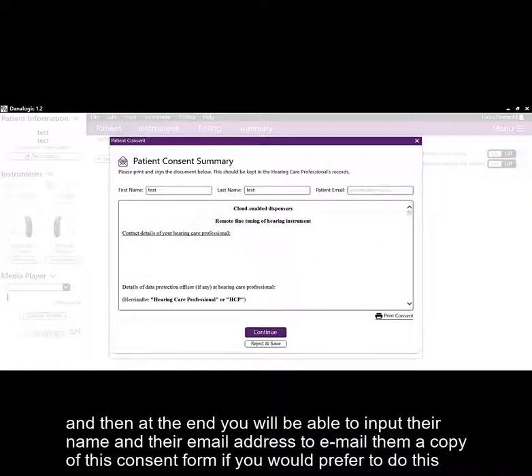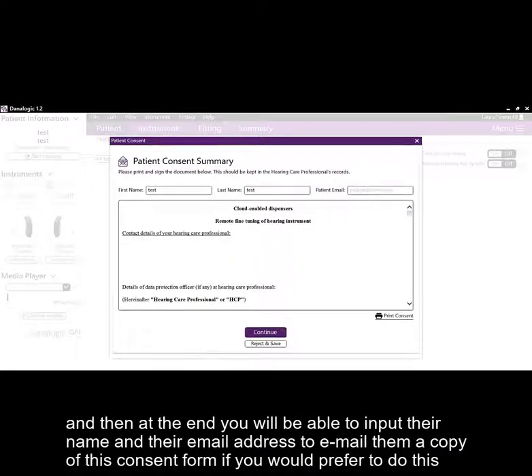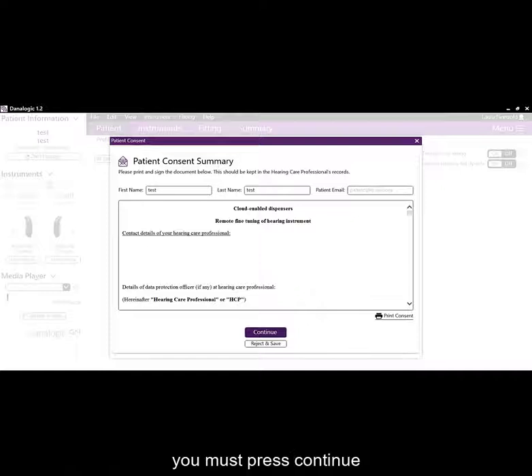And then at the end, you will be able to input their name and their email address to email them a copy of this consent form if you would prefer to do this. You must then press continue.